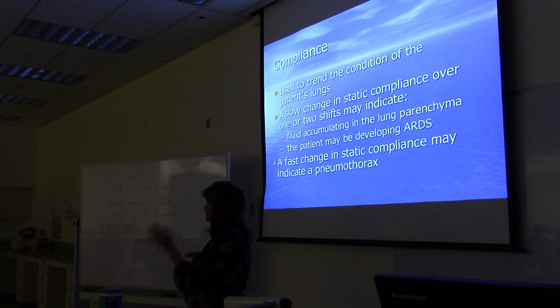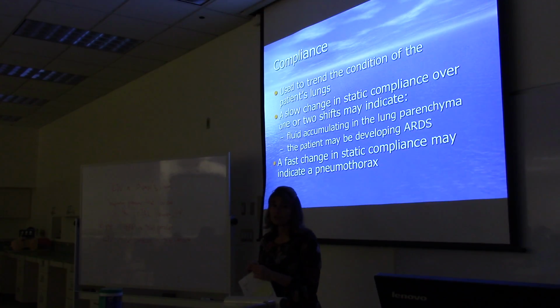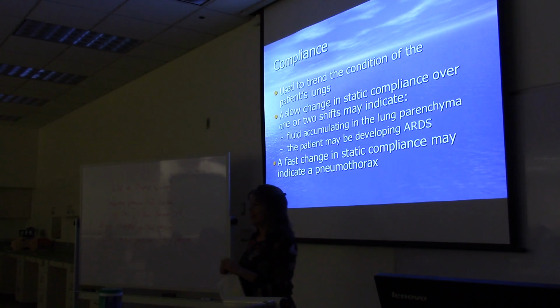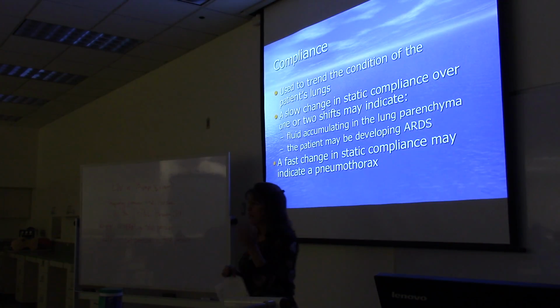It washes out the surfactants. Alveoli start to collapse. So that's ARDS. So you'll learn about it coming up soon, I'm sure. So when that happens, the alveoli become stiff, and you'll notice that your plateau pressures will be higher. So ARDS, stiff lungs, higher plateau pressure.